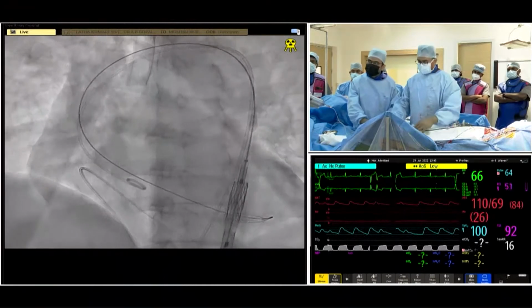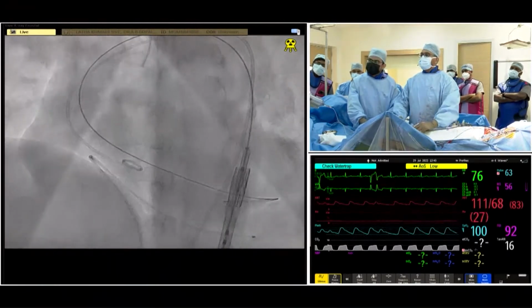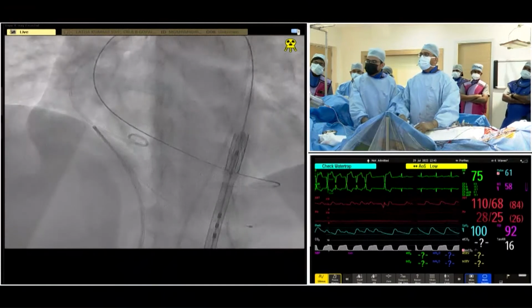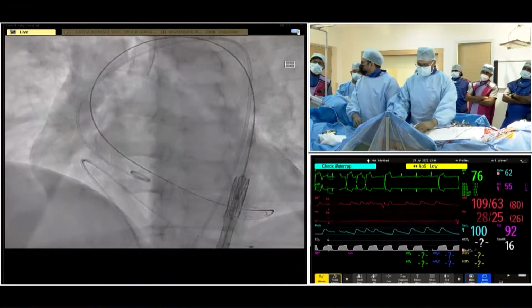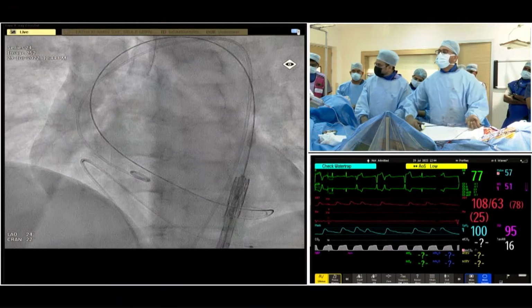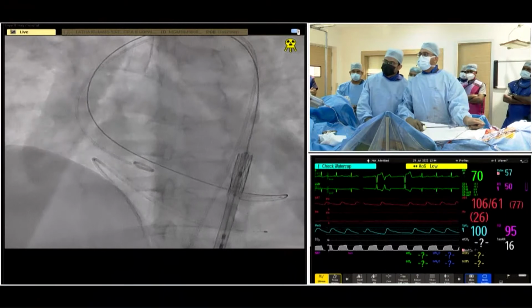Dr. Dilip had a question: why balloon expandable valve? In small annuli, we are looking at a trial called the SMART trial between balloon expandable and self-expandable. So Gopal, the question is actually, with a hypertrophied muscle with a small annulus, why do you go for a balloon expandable rather than a self-expandable?